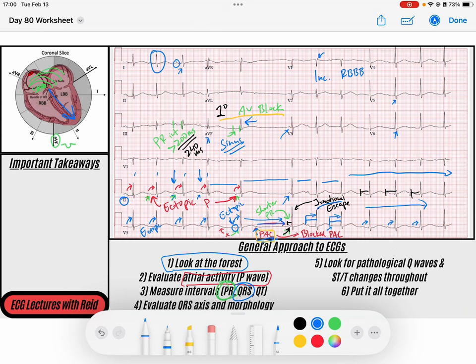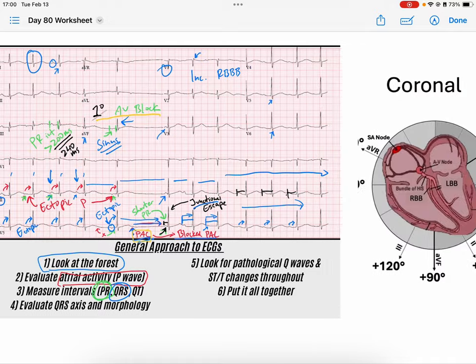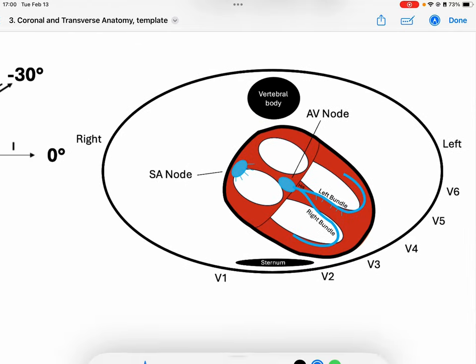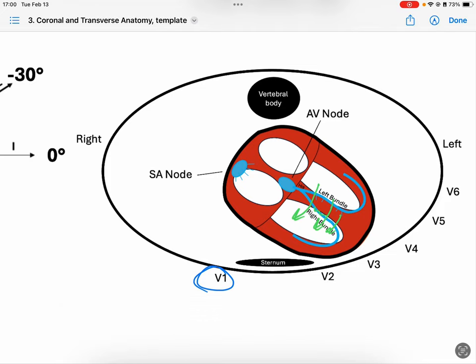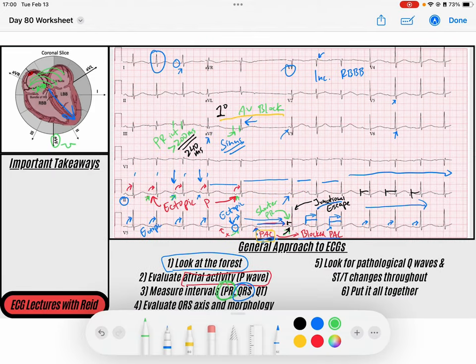V1 is capturing some late forces heading toward the right ventricle since that bundle branch is just a little bit diseased, giving us an incomplete right bundle branch block. Looking for pathological Q waves and ST and T wave changes throughout, we don't see any that are concerning in any anatomical pattern.